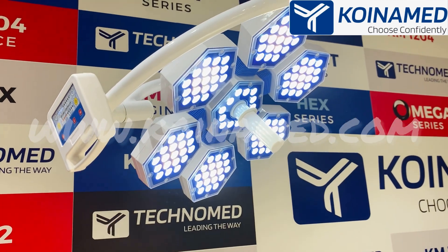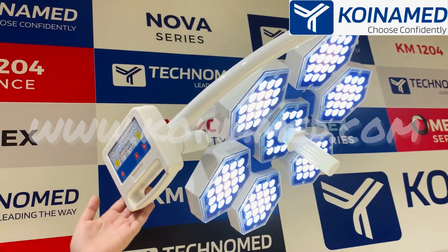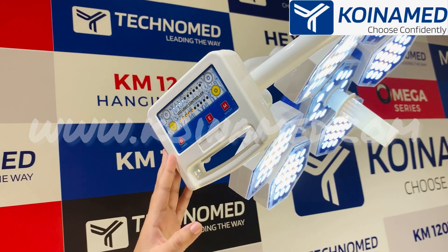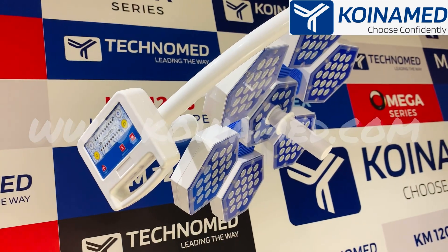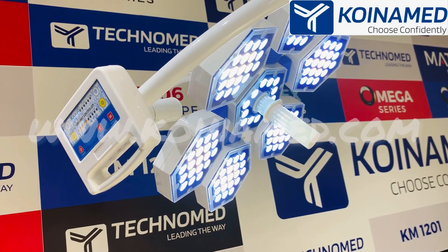This dome also has the same diameter of 500 mm and the same capacitive touch controller, with the same options: power, endo mode, and memory. By pressing the power button, with a single touch the light turns off, and with a single touch the light turns on.